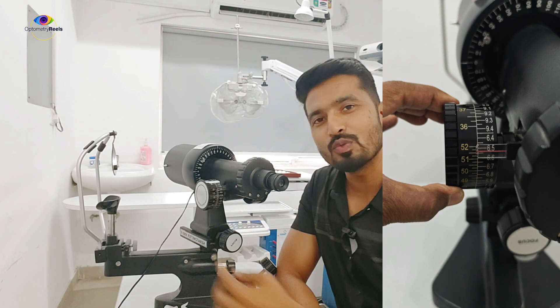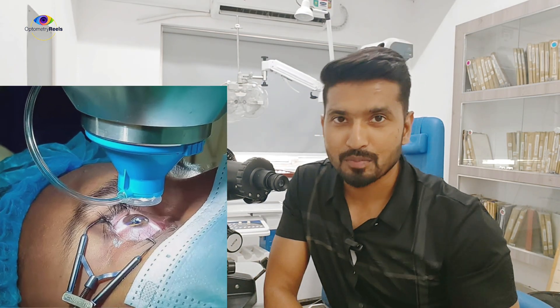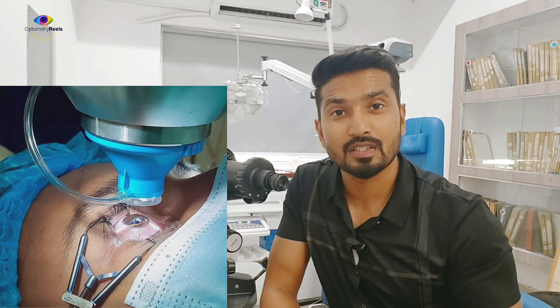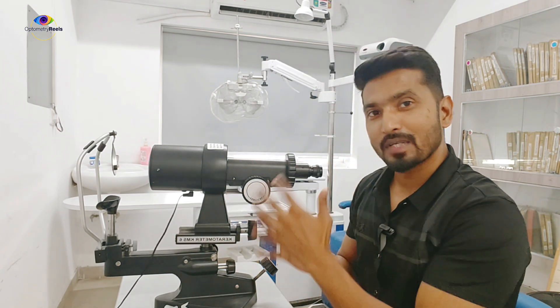In between 36 and 52, you can measure the cornea. But there are conditions like keratoconus or some other forms of ectasia, or a flat cornea like post-LASIK or post-refractive surgeries where the cornea becomes very flat — below 36 diopters — or the cornea is very steep, beyond 52 diopters. In this situation, how do you perform keratometry?